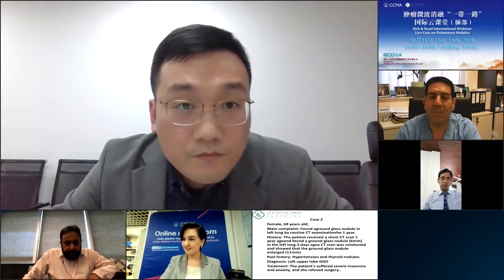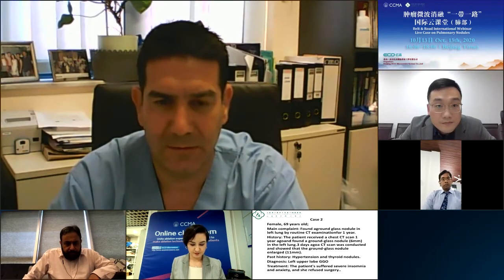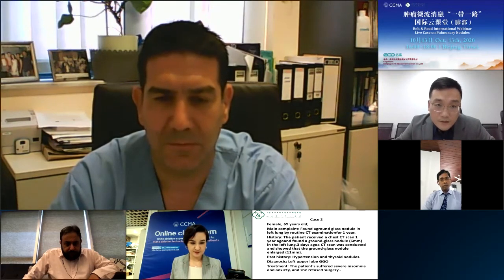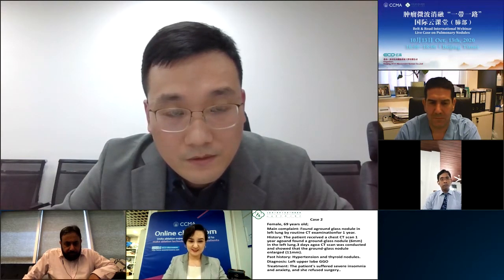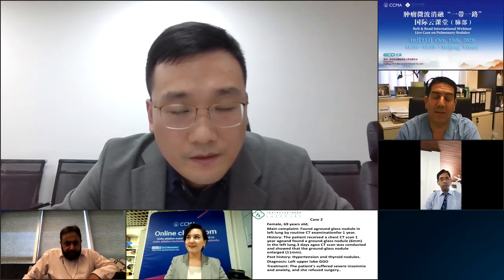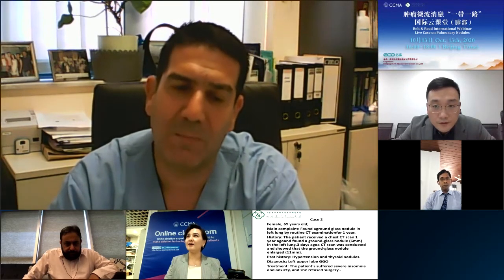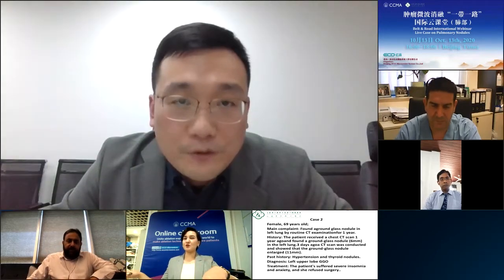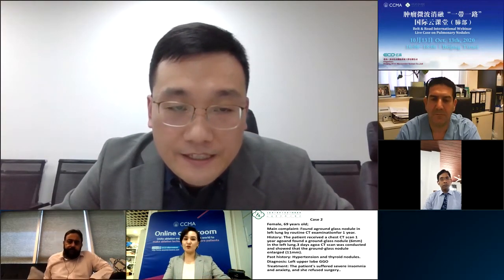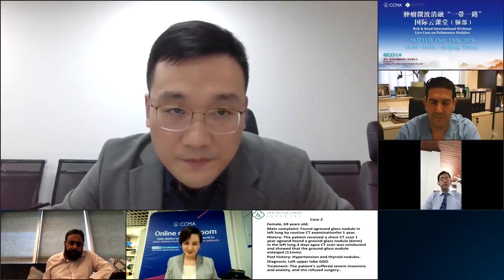So you do a quick pathology in the CT room before the ablation, correct? Quick, you mean quick resolution of the pathology examination? Yes, you do the biopsy before, and you do a quick pathology report at the same time as the ablation. We do the biopsy before the ablation, and we do quick histology examination with frozen specimens.